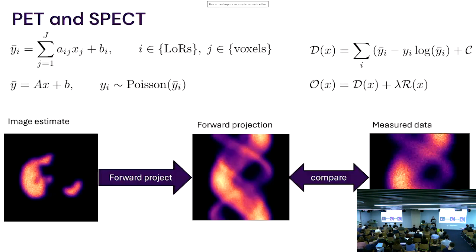And if PET and SPECT, or any of multiple radionuclides, are reconstructed separately, and these are injected into the same patient or are part of the same radionuclide, then you throw away a lot of joint structural information between those two different modalities or nuclides.